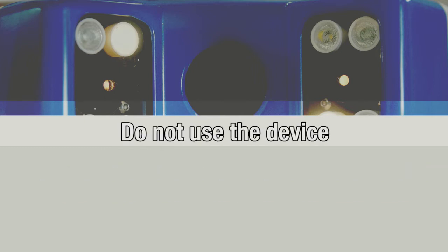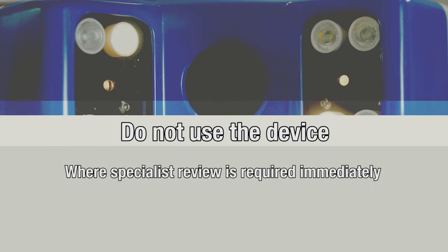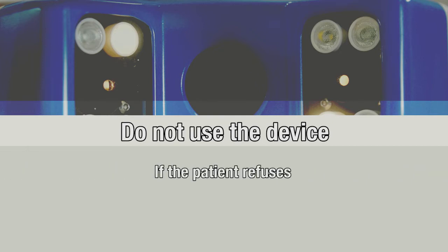You should not use the eyeConnect device when the patient can be managed without eyeConnect support, or it is apparent that specialist review is required immediately, where capturing information delays appropriate care, for example, chemical burns. Also do not use it if the patient has open facial wounds, or if the patient refuses.